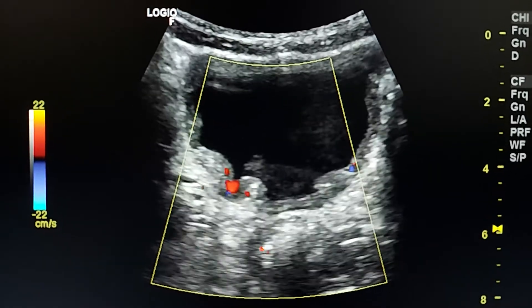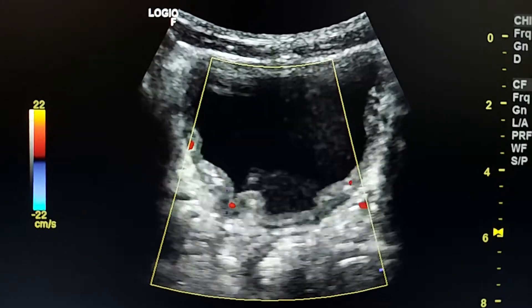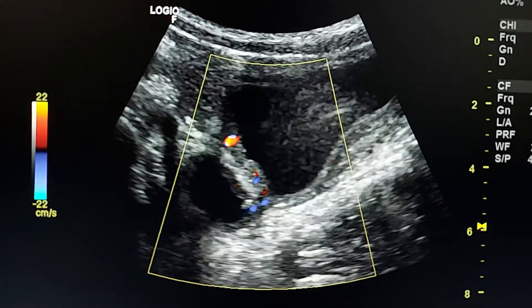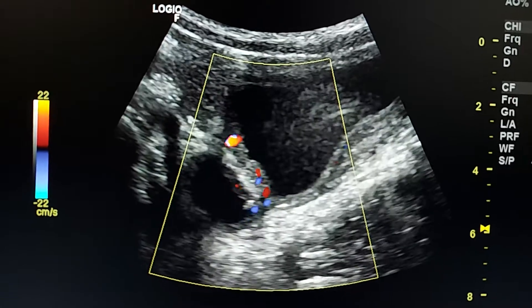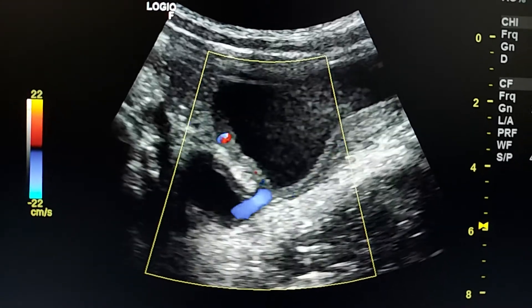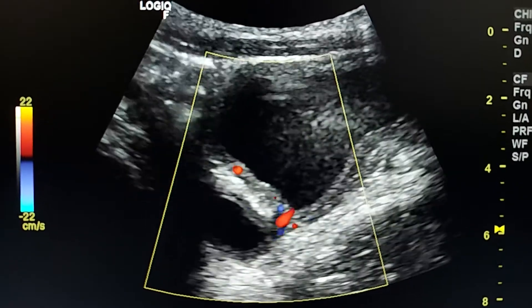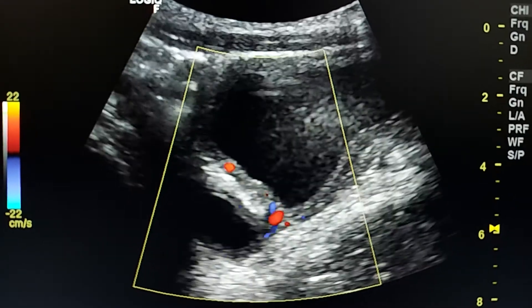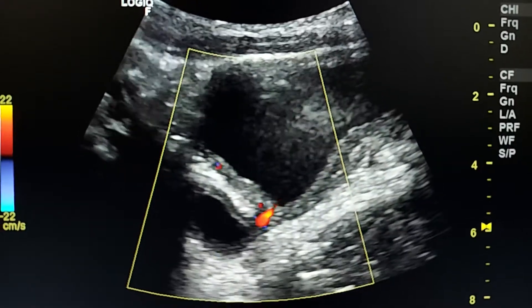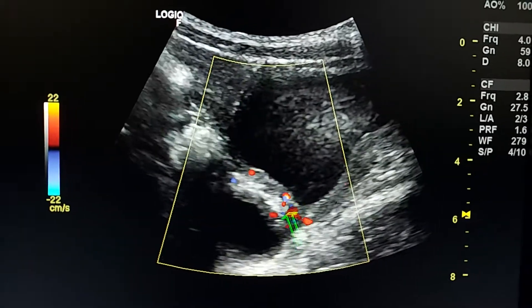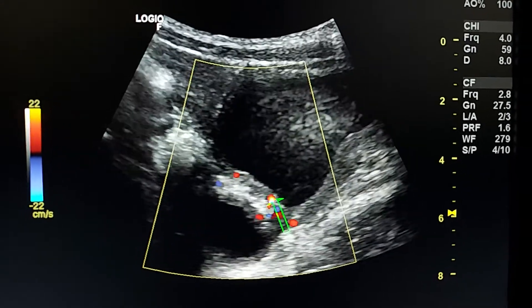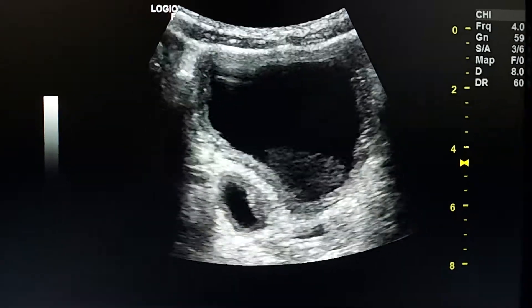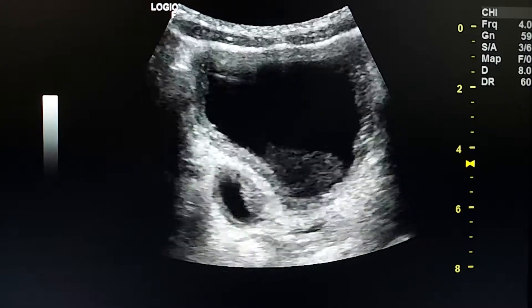Here we see the left ureteric jet at the same time. We see the flow towards the diverticulum from the neck, and here we see the flow across the neck from the diverticulum to the urinary bladder towards the probe. It was confirmed by cystoscopic ureteric evaluation.